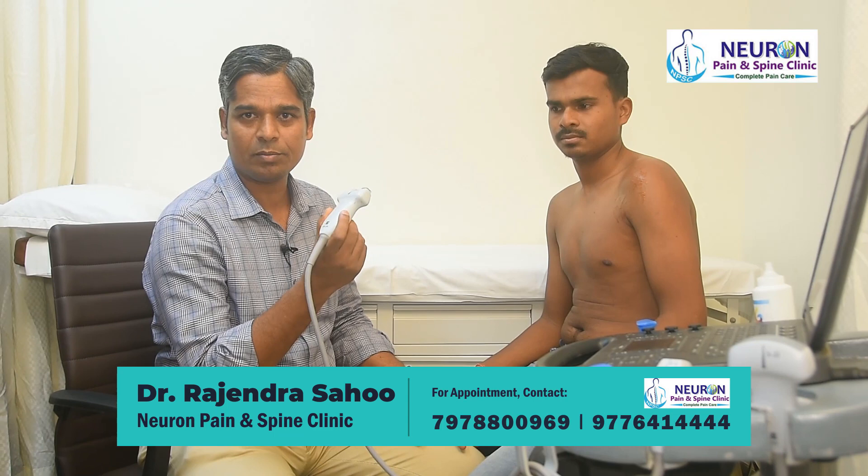In this video today I'm going to demonstrate a step-by-step approach to scan a normal shoulder joint — a protocolized shoulder joint scanning technique. For this, I make the patient remain seated comfortably in front of me in a chair or stool. I sit in front of the patient with the machine, and I'm using a high-frequency linear probe.